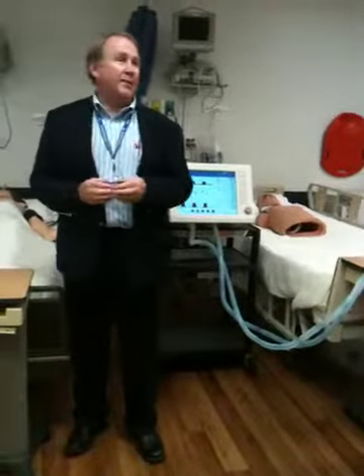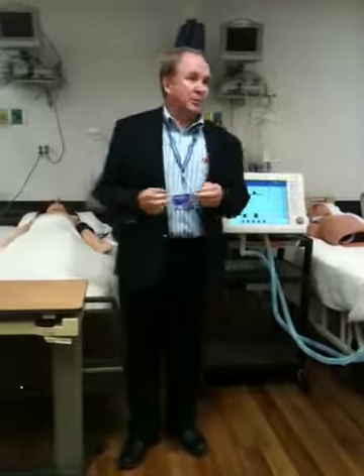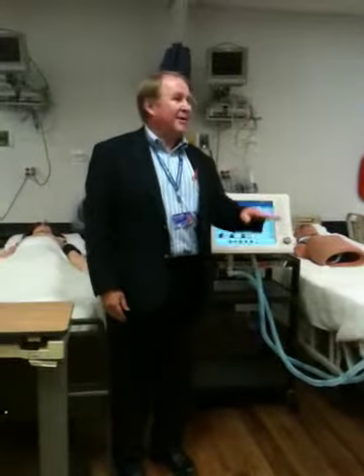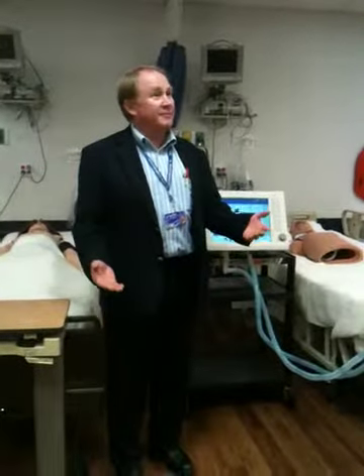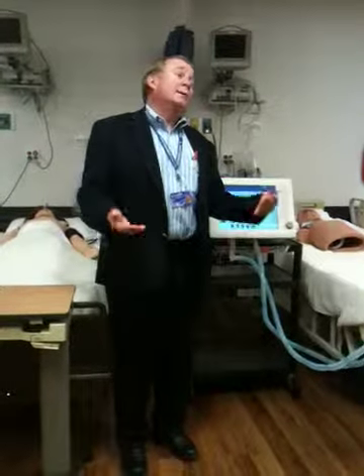I can also look at breath by breath, because just because 80% of it was being done by the patient, that other 20%, was it done all at one time, like the patient quit breathing altogether? Some of your patients are going to do that. Call it periodic breathing. They will breathe for a while and then they stop. In Cheyne-Stokes breathing, they do that about every 30 seconds. You're counting the respirations, 1, 2, 3, 4, 5, 6, and they do nothing for about 10 to as many as 20 seconds. And then they breathe again.